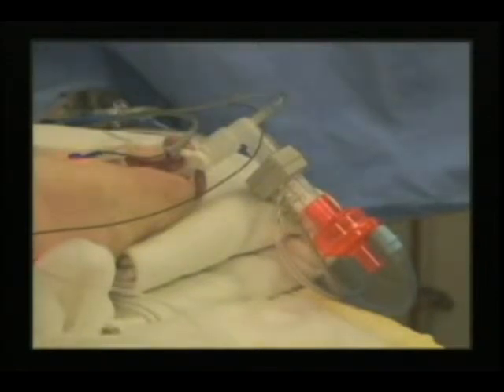Respiratory rates range between 25 and 30 breaths per minute. Heart rate has stayed between 190 and 200 beats per minute, and the tidal volume has ranged between 180 and 200 cc's. It's important to note this pig received no fluid therapy. We did not return any blood, and it maintained its systolic blood pressure in this particular study for well over 30 minutes at 80 over 55 millimeters of mercury.